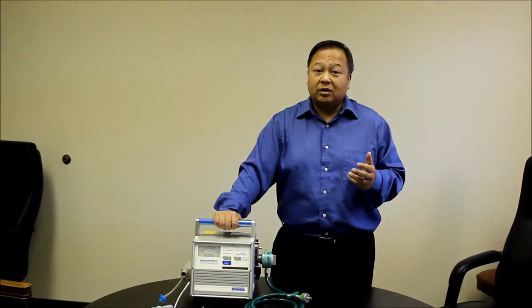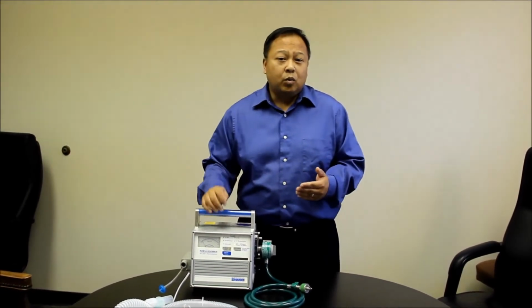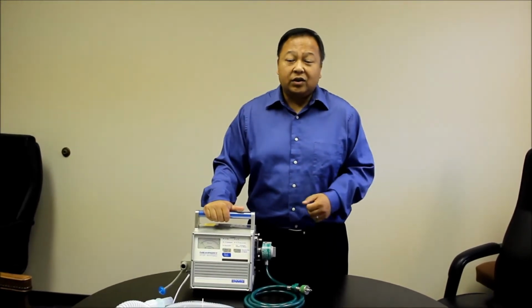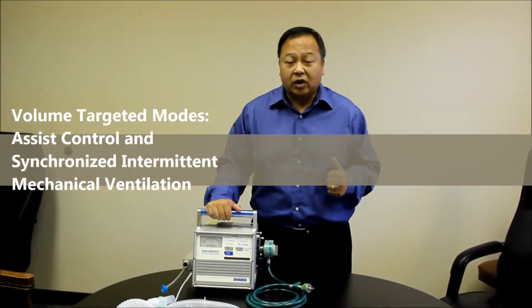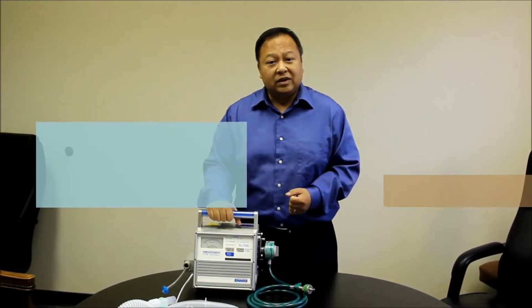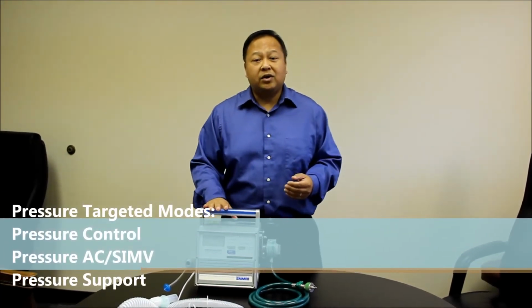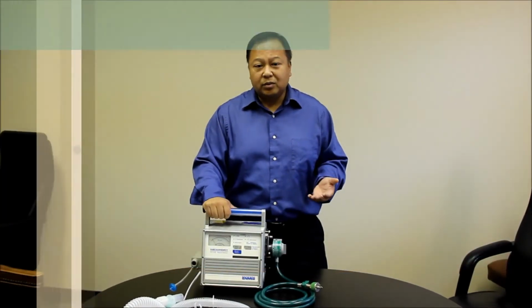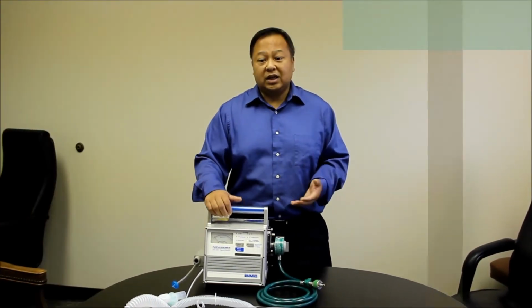Now that we know that when a patient needs ventilation, we put them on a ventilator, the second thing is what modes of ventilation a ventilator can provide. There are different modes. First, we have volume control ventilation, where we control the volume that the patients are getting. The second mode is pressure control ventilation, where we use pressure to control the amount of ventilation necessary for the patient. Another mode is PRVC. We don't see that much, but it is another mode that is out there.